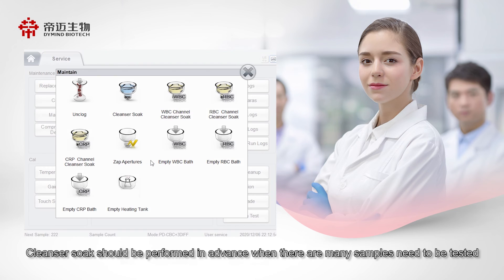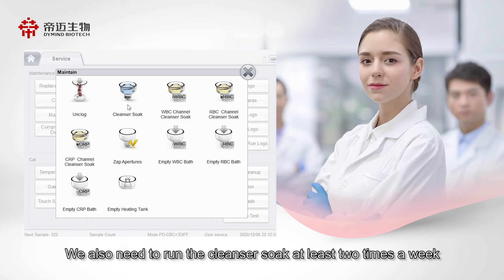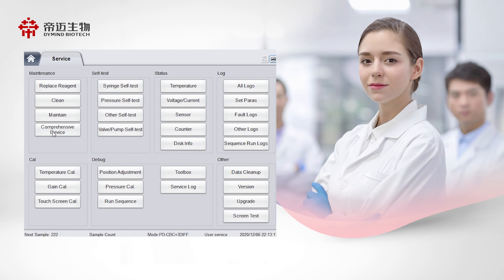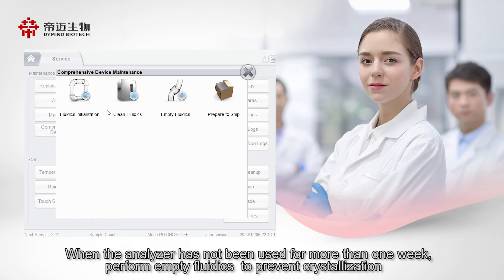Cleanse or soak should be performed in advance when there are many samples to be tested. We also need to run the cleanser soak at least two times a week. When the analyzer has not been used for more than one week, perform empty fluidics to prevent crystallization.